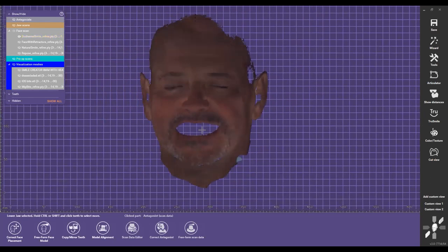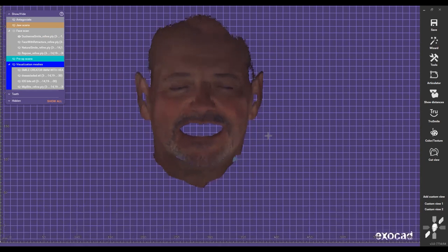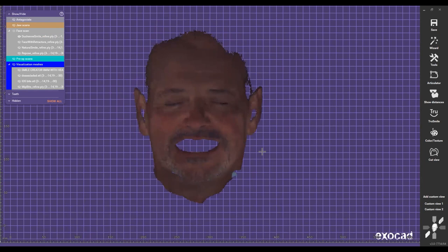So we can get rid of canted smiles, midlines, occlusion, because there are more remakes with these cases, right? More remakes, because the bites are off, the midlines are off, the canted smiles, right? There are more remakes of these cases with these problems than the cases with misfits, right? And we're trying to bring photogrammetry users to our level, so that they can see that, okay, we have implant position and we have aesthetics and everything, so we can nail everything. And that's why we decided to integrate with photogrammetry, so that we can help improve their workflows at the same time.